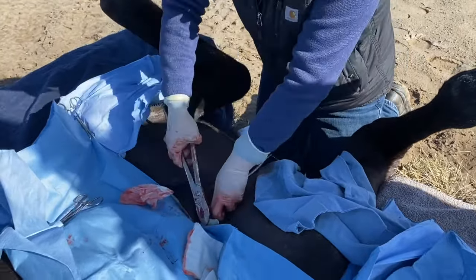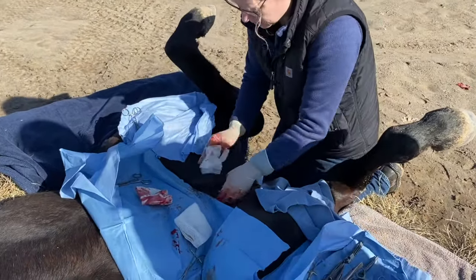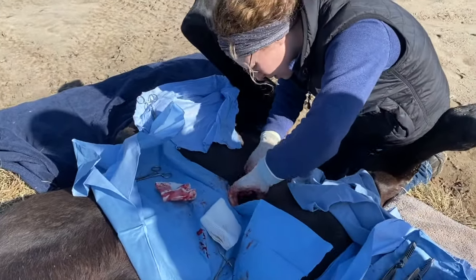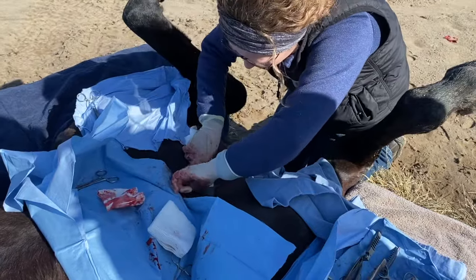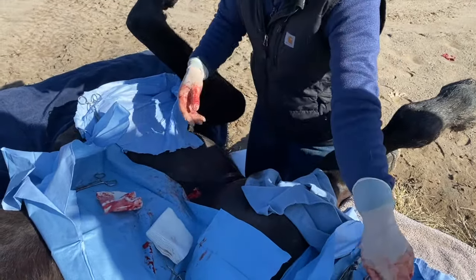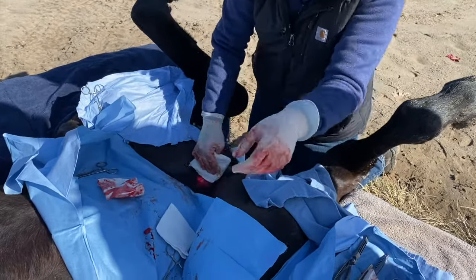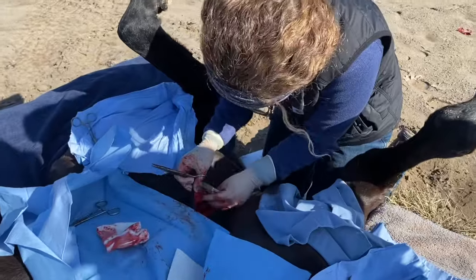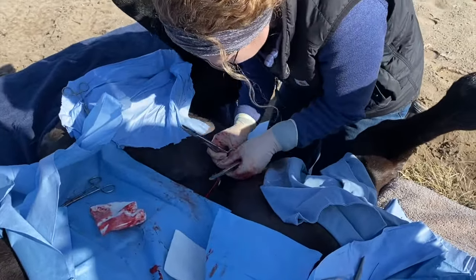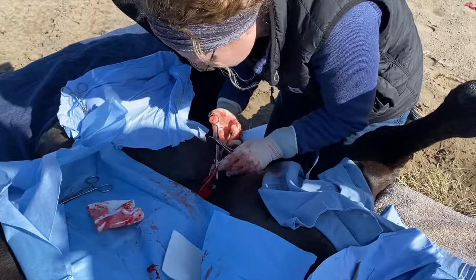After an appropriate amount of crush time for the patient size, the emasculators are removed from the spermatic cord and cremaster muscle. The right and left sides are visually inspected for any excess bleeding. Any small pieces of fascia at the incision edges are trimmed away and the incision is stretched to allow better drainage.